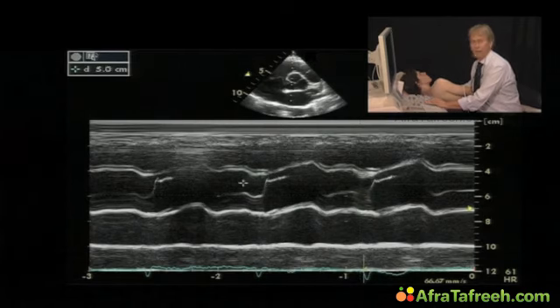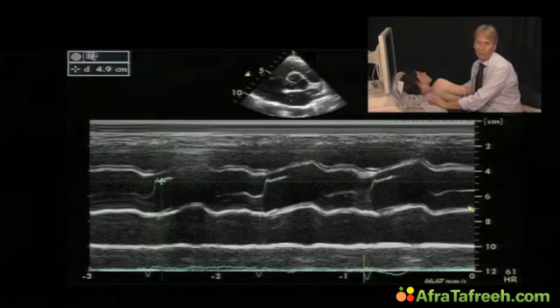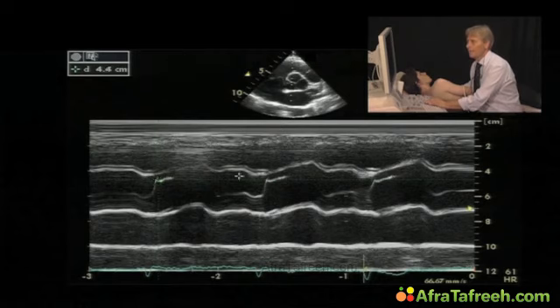What you can see very often are little fibrillations of the cusps, which is normal. Sometimes they're more, sometimes they're less. So this is not a pathologic finding. When we do the measurement, we perform it exactly at end diastole, so shortly before the aortic valve opens. So this would exactly be the best point to do the measurement.